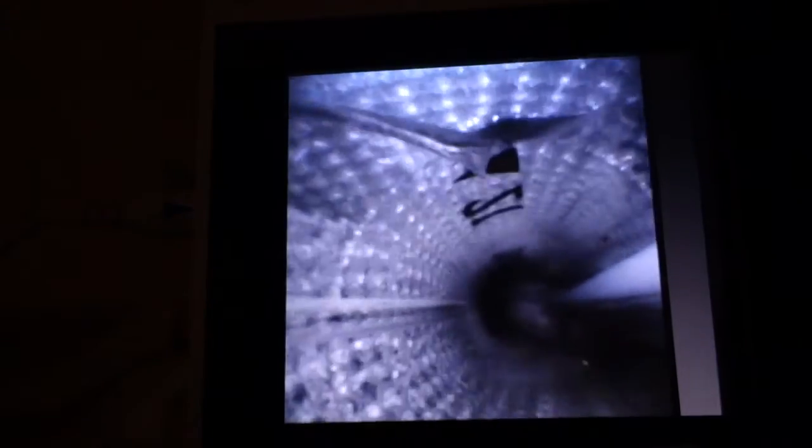The towel might give a little bit of difficulty, as you might anticipate, but that's the way it is clinically with various soft tissues. So now I am entering on the left fake bronchus. And again, I'm going to go rather quickly through it because there's no dexterity there and get to the targets for more practice.